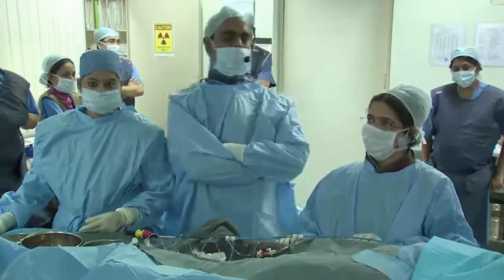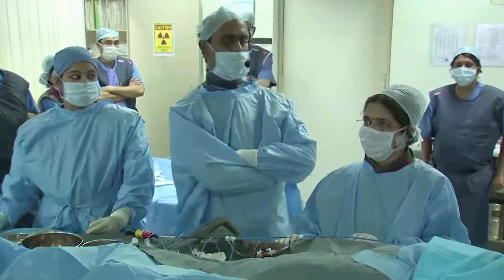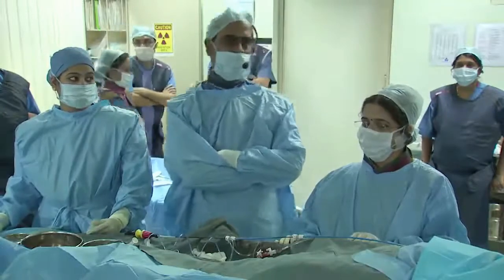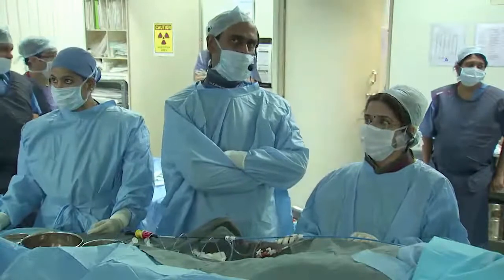I already mentioned a complete balloon occlusion resulted in a Fontan pressure going up to 16 millimeters of mercury, and the transpulmonary gradient was 8 to 9. We were not happy to close it completely. We feel that he may not tolerate a complete closure.